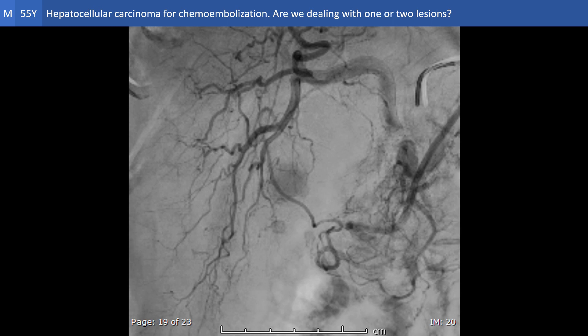Leaving you now with the next case: a male, 55 years old, with hepatocellular carcinoma. Hepatic arteriography has been done before chemoembolization, and the question we are going to discuss next time is whether we are dealing with one region or two regions of delivery.